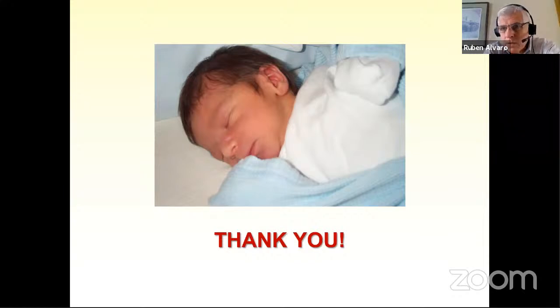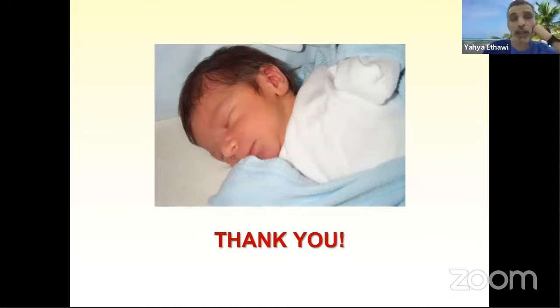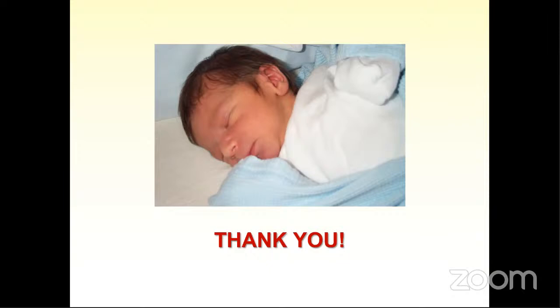We don't intubate babies prophylactically anymore. So you don't give prophylactic surfactant? Well, we do, by LISA or MIST. We had a baby 3 days ago, a 25-weeker born at 700 grams. It took us about 5 minutes to get the baby stable just with nasal CPAP. We had to use a higher PEEP at the beginning for the first few breaths, up to 10, 11, and then we brought the PEEP down right away as the baby started breathing. He was requiring 50% oxygen on nasal CPAP of 7 or 8, so we decided to give surfactant, but we did it by LISA.